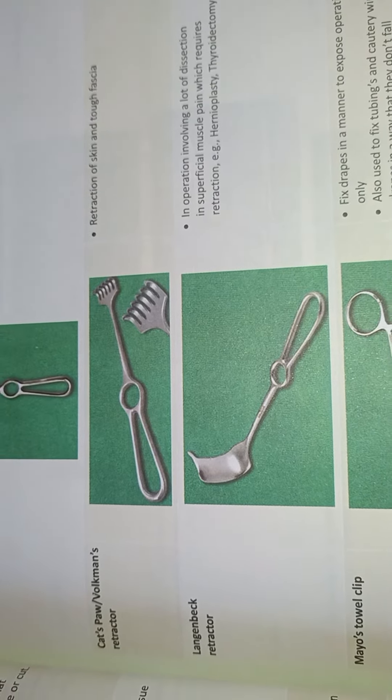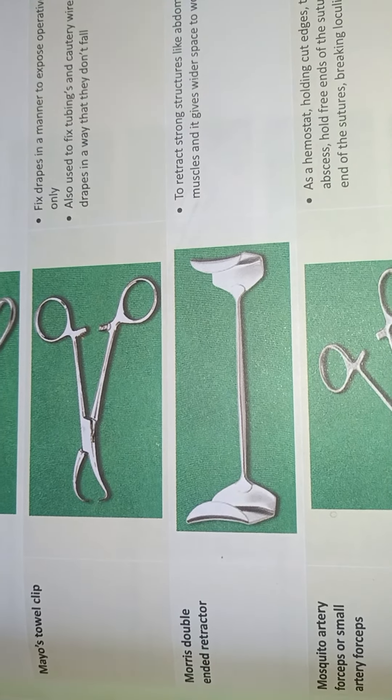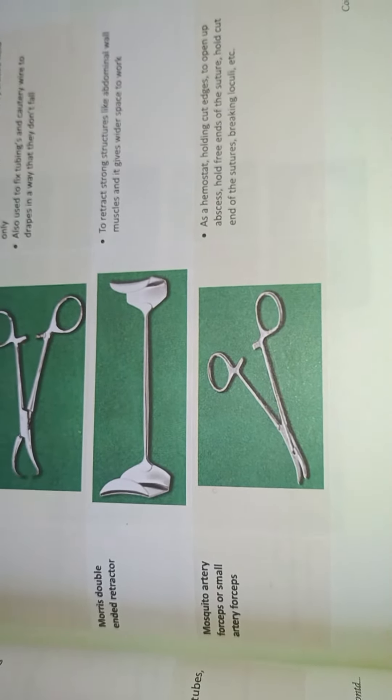Langenbeck Retractor, Mayo's Towel Clip. Morris Double Ended Retractor. Mosquito Artery.